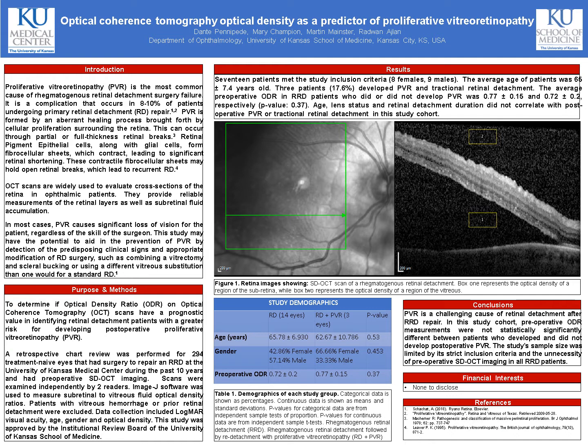Future studies could examine a cohort for which OCT scans are ordered on all retinal detachment patients prior to repair and are prospectively followed for the development of PVR in a specific period of time in order to examine if ODR can predict those who will face complications from PVR.